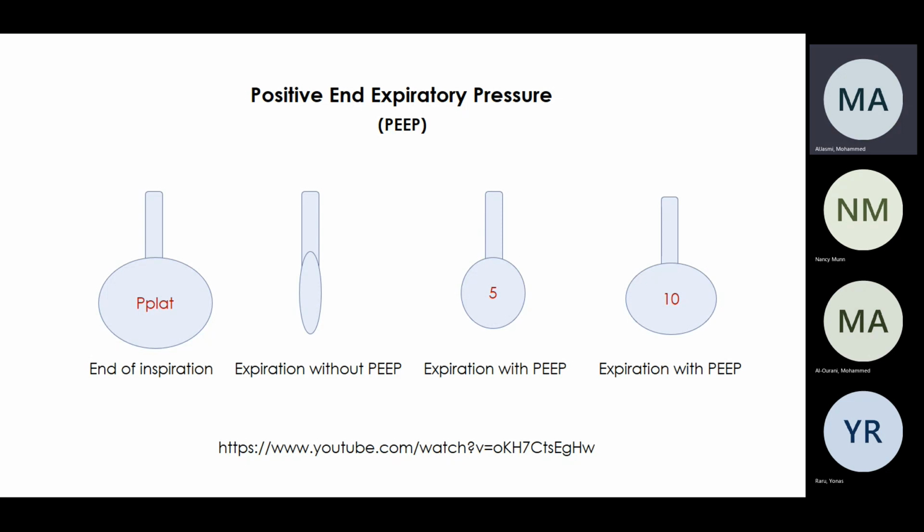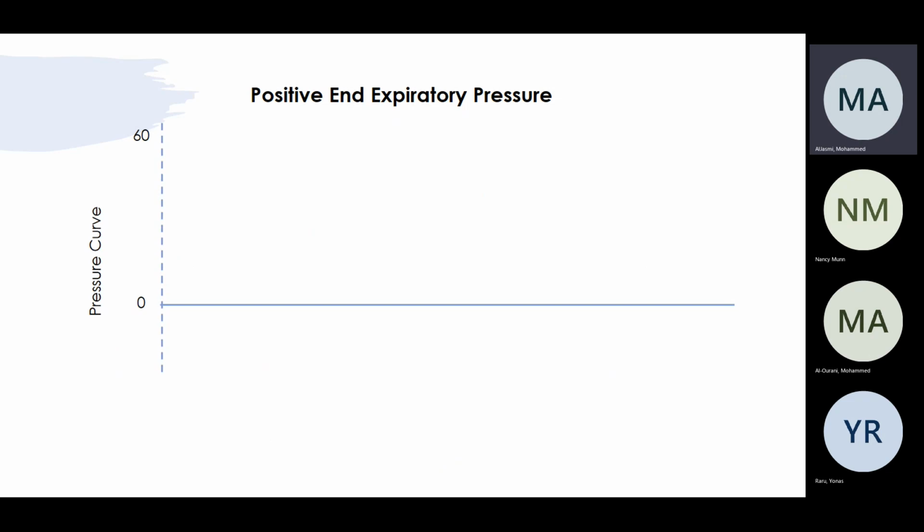The thing is, clinically as a physician, it's easy to memorize: let's just put 5 PEEP, 10 of PEEP, 12 of PEEP. But the main important thing is to think about it. What's enough PEEP for this patient? What's the PEEP that will lead to more rupture, and what's the PEEP that will lead to recruitment? We'll talk about this more, okay?